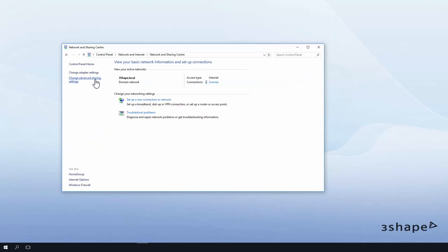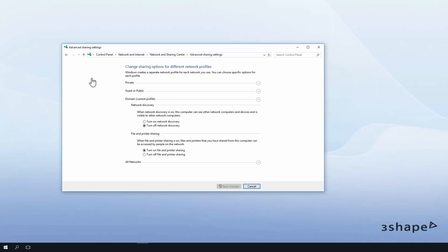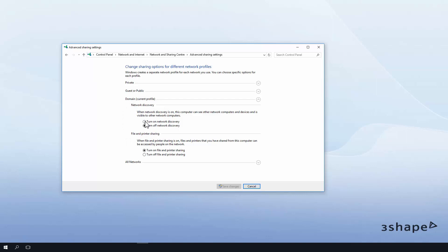In the left pane, click Change Advanced Sharing Settings. In the current network profile, click Turn on Network Discovery and then click Save Changes.